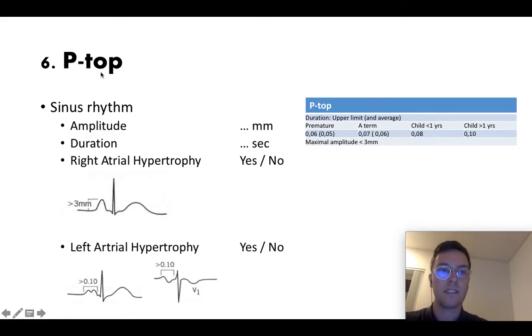Then step six, look at the P-tops. First of all check if it's in sinus rhythm. If it is, check the amplitude of your P-tops, the duration of them in seconds. Check if there is right atrial hypertrophy. You can see this if the P-top is higher than three millimeters as this figure shows. Or check if there is left atrial hypertrophy which is when the P-top takes more than 0.10 seconds. Here again I added some normal values.